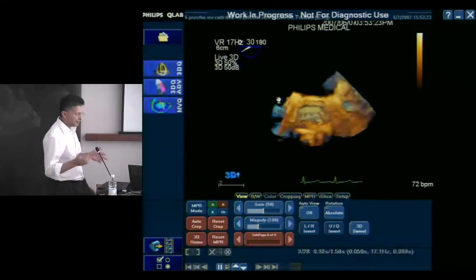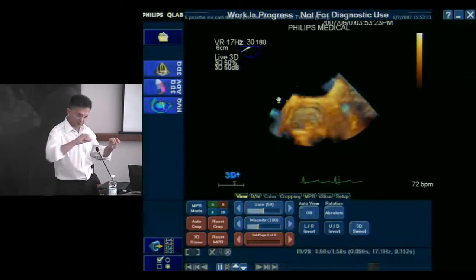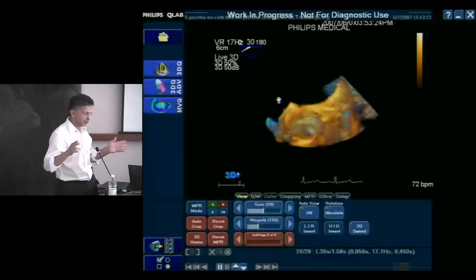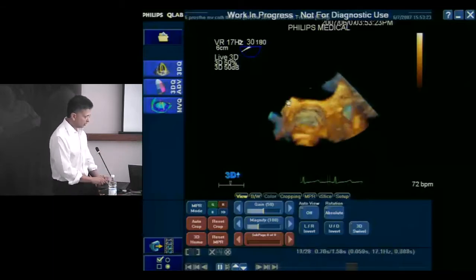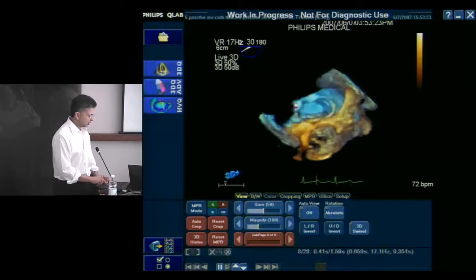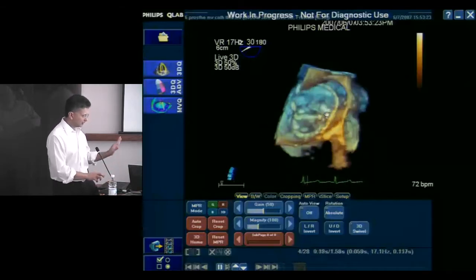And she came back to us a couple of times after that because she had paravalvular leaks around the prosthetic mitral valve. And she was transfusion dependent with hemolysis. So the question was, where? And we put in 2 Amplatzer devices and so on.